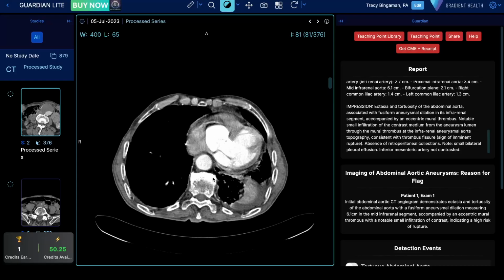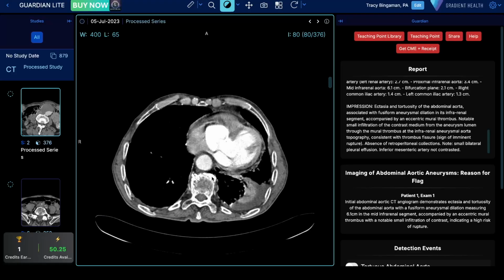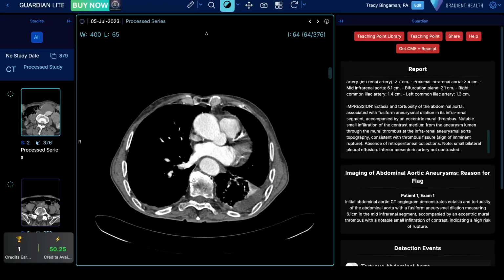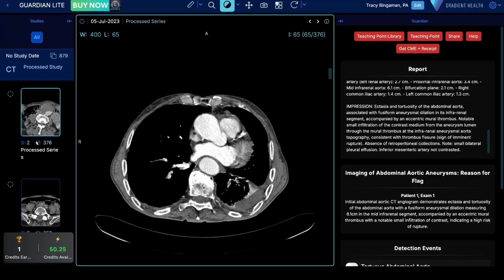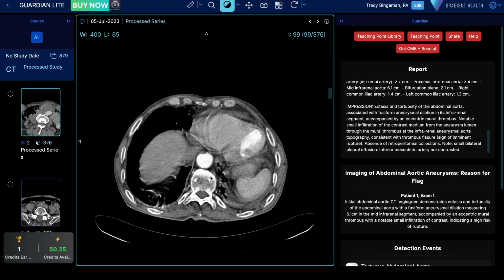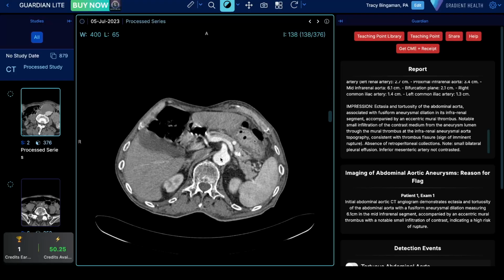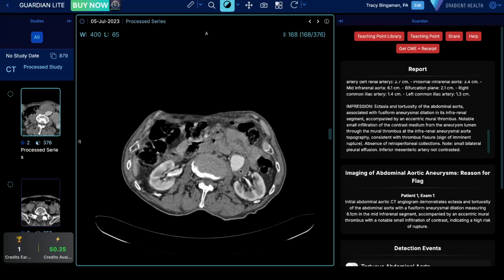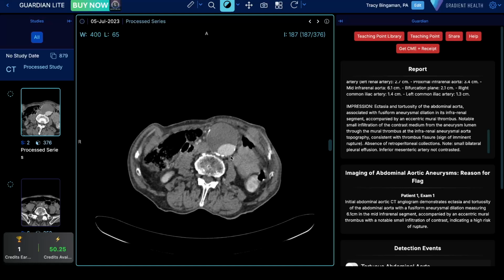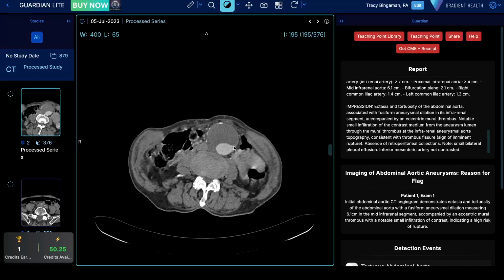So all the way up, we see a little bit of these pleural effusions here, which looks to me like left greater than right, but both are relatively small without a big, huge collection there. Following this aorta down, down, down, you do see some of this tortuosity here with some aneurysm. And then here is kind of this money shot of really profound dilation, a little bit of infiltration here.